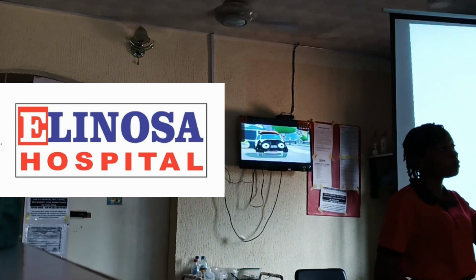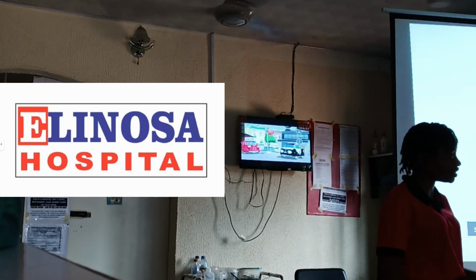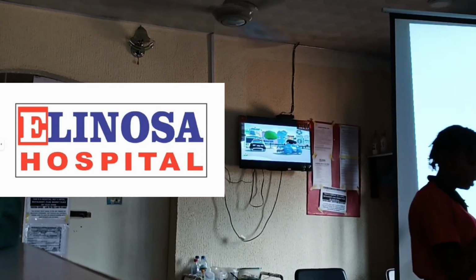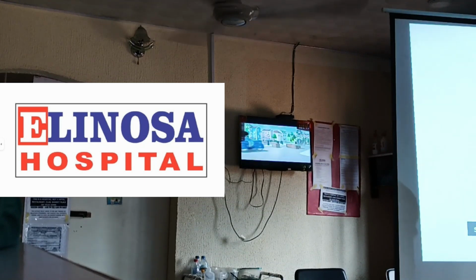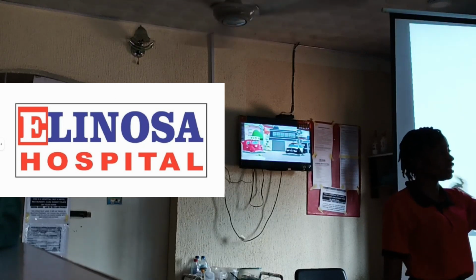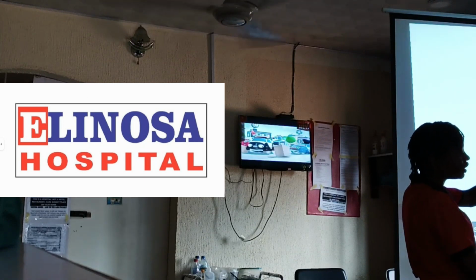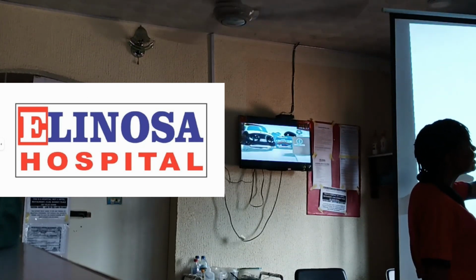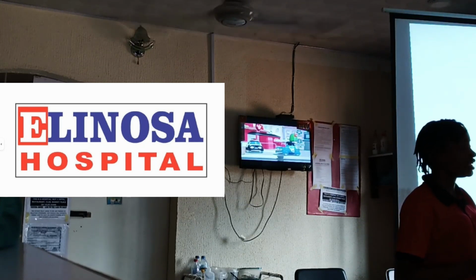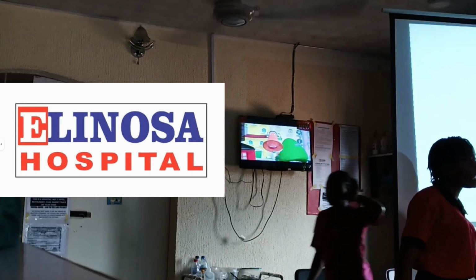Now this EDTA is a multi-purpose anticoagulant normally used for the majority of hematology tests like ESR, erythrocyte sedimentation rate, PCV, and so on, or serological tests. Then this is your lithium heparin, normally used for chemistry tests like your E/U/Cr: electrolytes, urea, and creatinine. The heparin in this container prevents the blood from clotting, while the lithium in it forms a complex that does not interfere with electrolytes, because now you are testing for electrolytes, urea and creatinine.